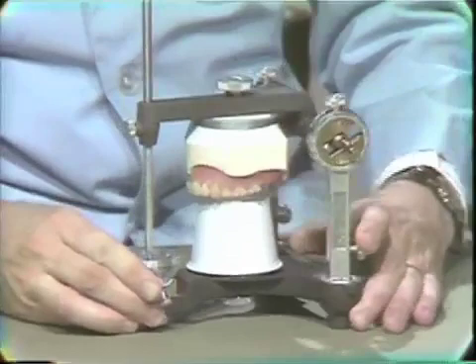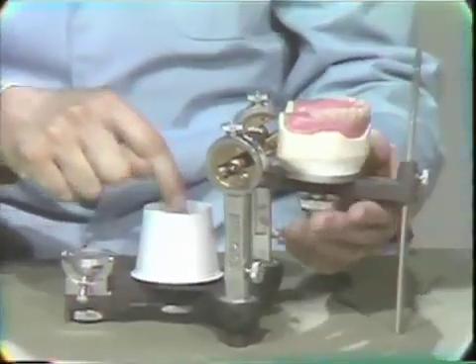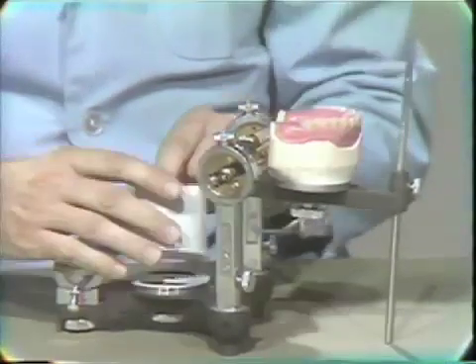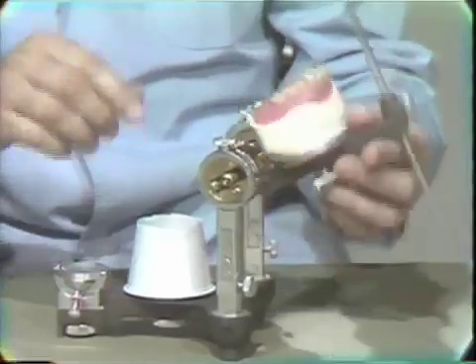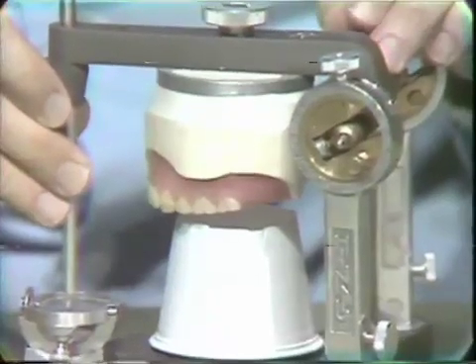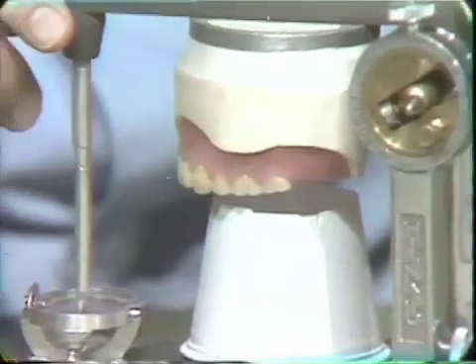Now the next step is quite obvious. We simply pour a mixture of impression plaster into the cup so it gets into the undercuts of the ring, and then the excess comes over the top of the cup. We simply lower the denture onto the wet plaster until the pin touches and let it set.